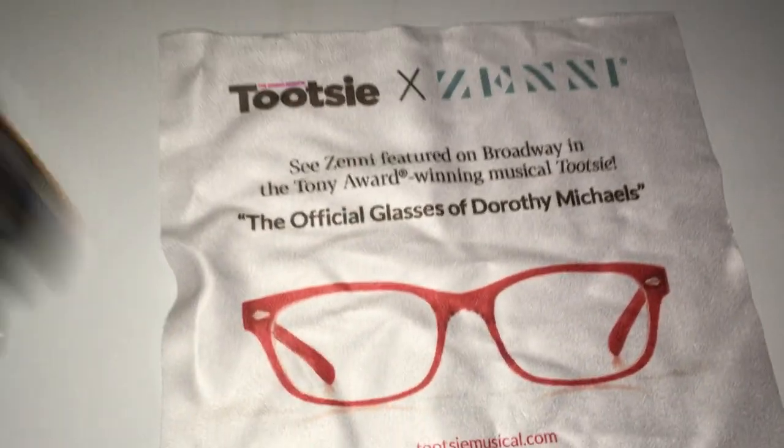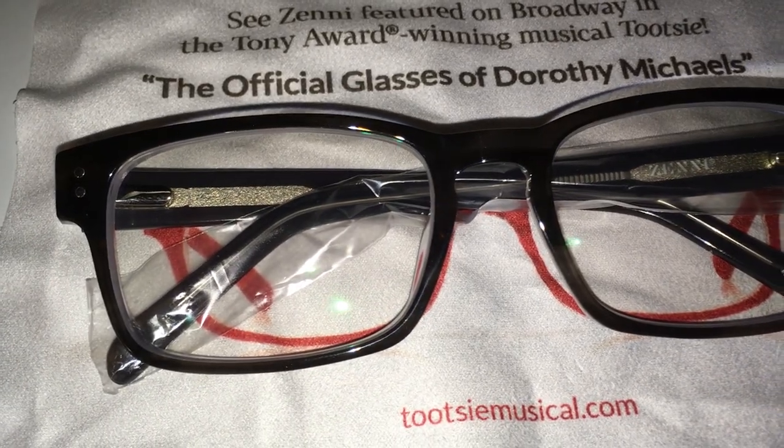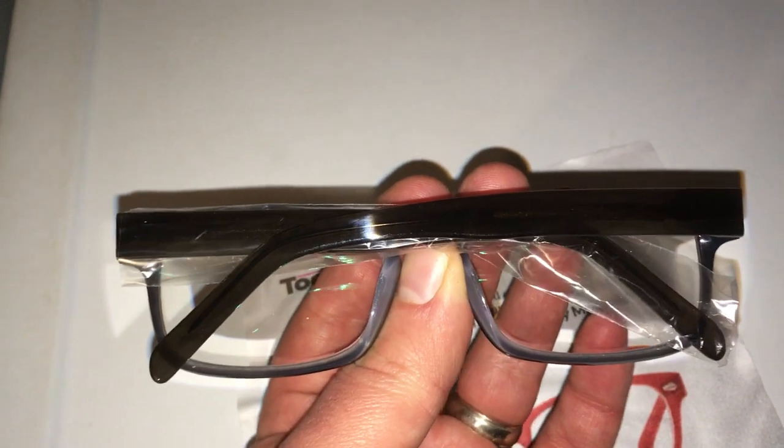The glasses themselves are wrapped up in a glass cloth. Glass cloth action! So here are the actual glasses themselves. I think they look pretty poppin. And then that side of the glass — so yeah, there be some new glasses on the noggin right there. I like them.